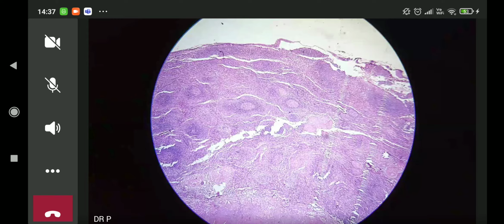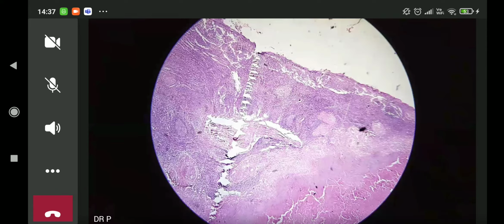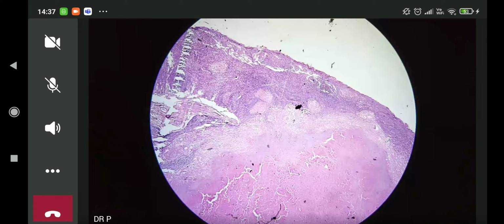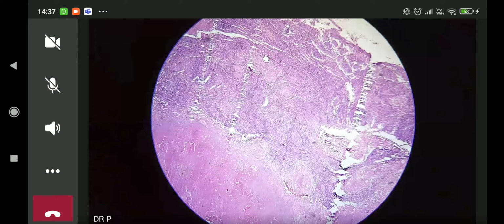Now, vis-a-vis the spleen, why did the students say spleen? Well, maybe because splenic histology is characterized by the presence of two components. One is the white pulp and one is the red pulp. So if you think that this is red pulp and this is the white pulp of lymphoid follicles, then you would be thinking that it's a spleen. But you have to understand that you are not in year 1 anymore, you're in year 2, where you're dealing with pathology and disease.